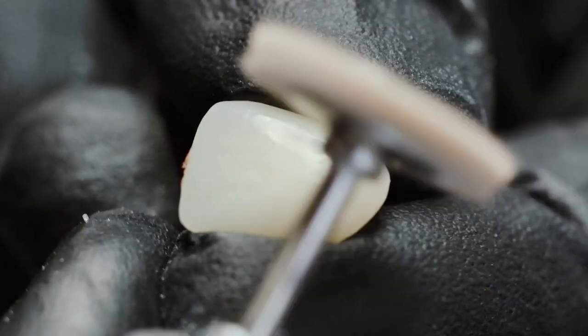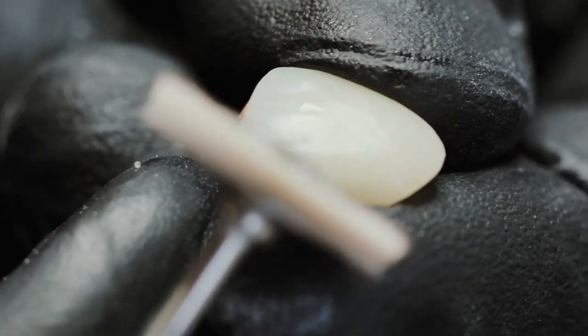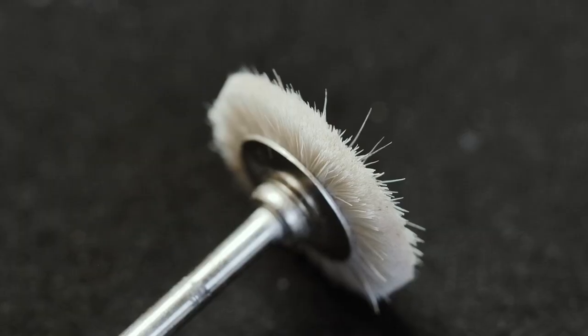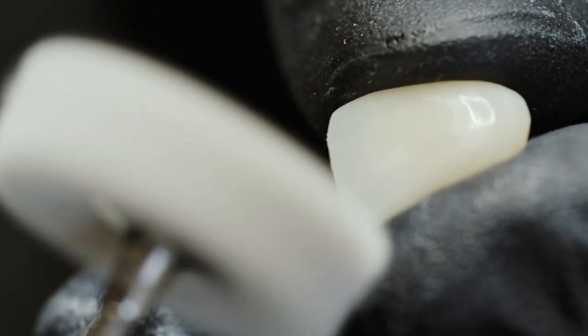Finally, I show you how quick and easy it is to polish an Edelweiss crown. I only use a brush made of goat hair and one made of cotton. Not having to use rubber polishes not only saves money, it also means not risking surface loss.